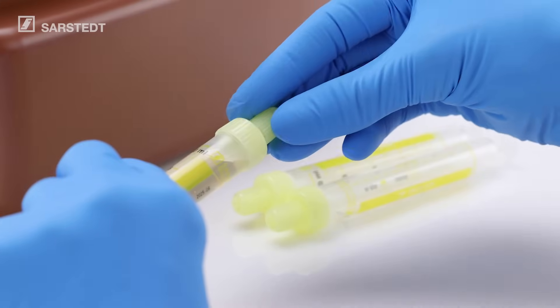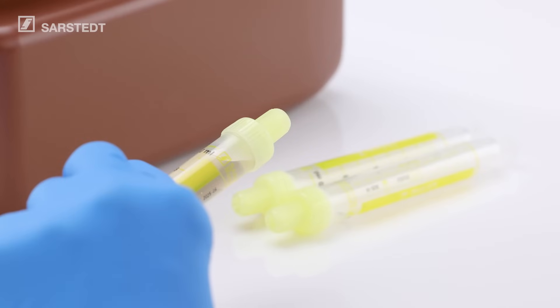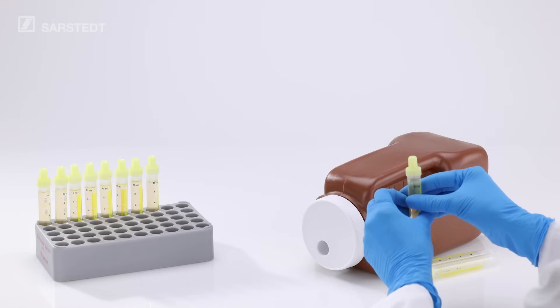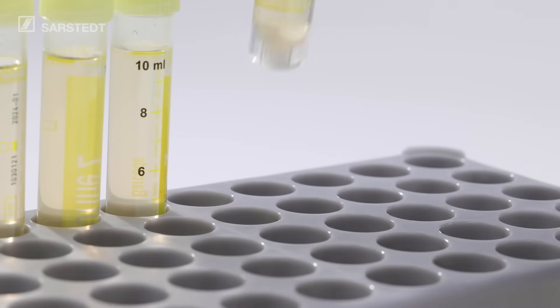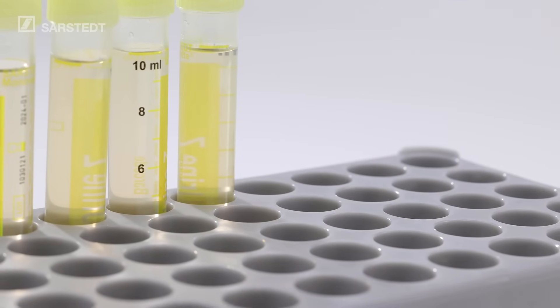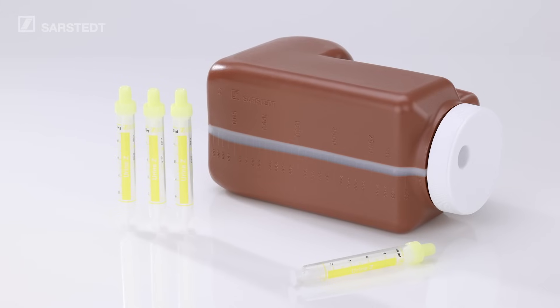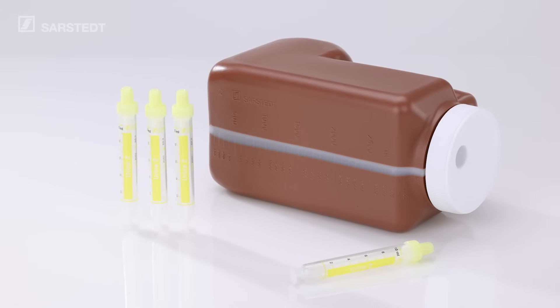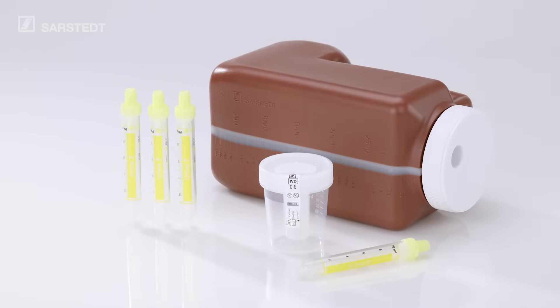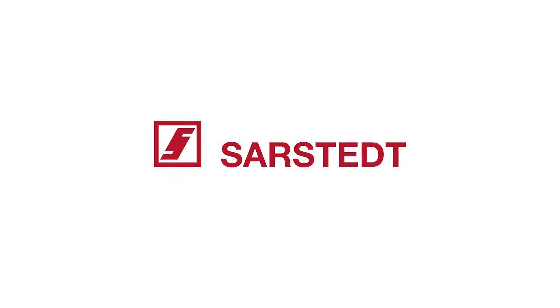Hygienic. Practical. Safe. The NFT collection system from Sarsted sets the new standard for accurate pre-analytics suitable for routine use, combined with the greatest safety for users and patients. The NFT Urine Collection System for Sarsted — this is Urine Pre-Analytics 2.0. Sarsted, your partner in medicine and science worldwide.